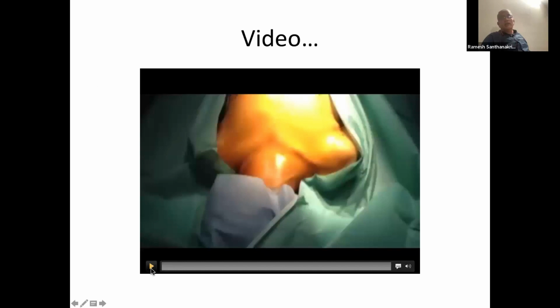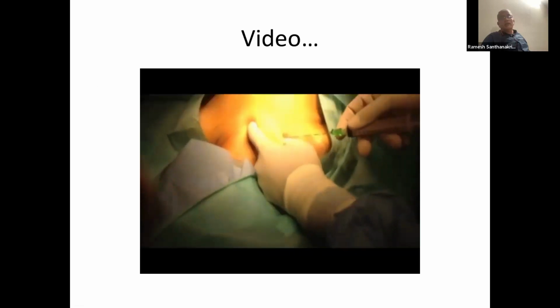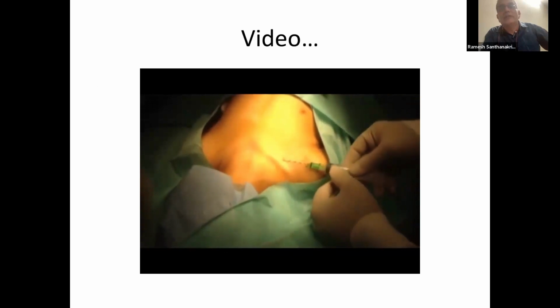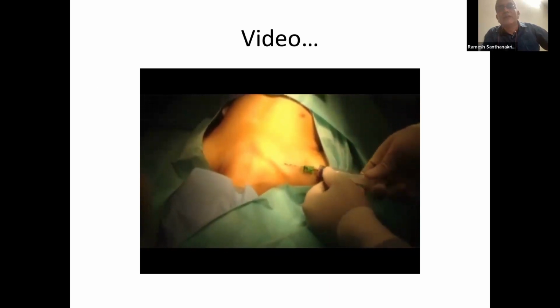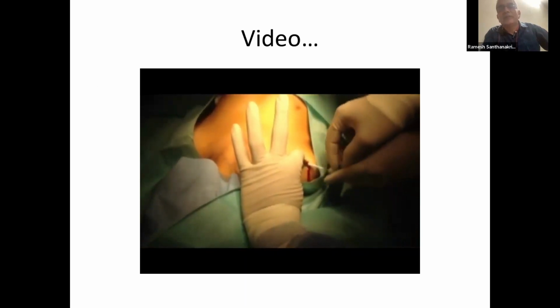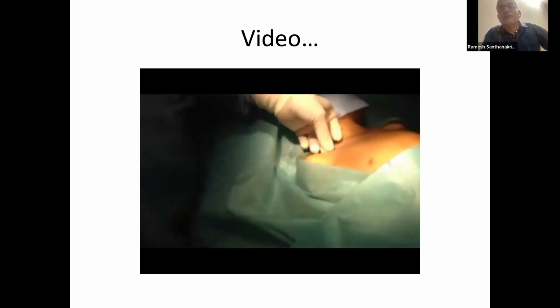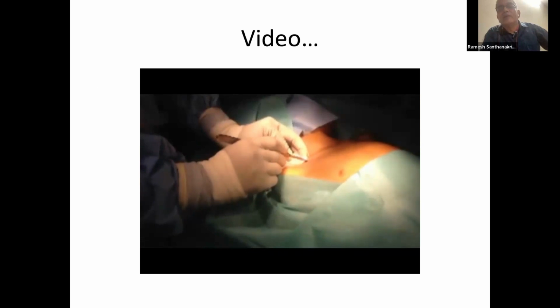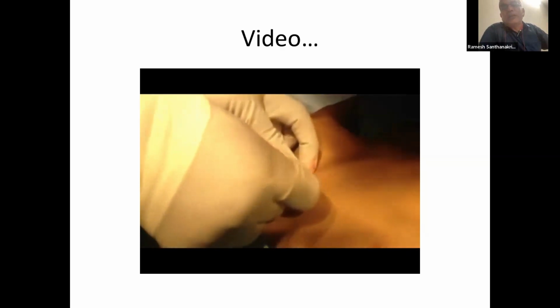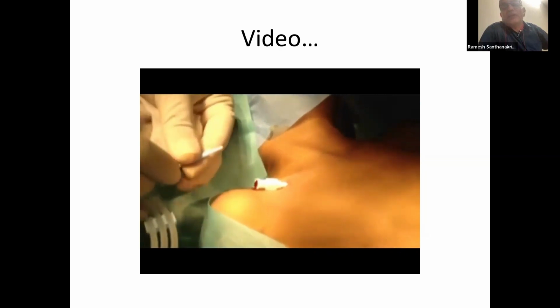Okay, this is a video. I don't know if anybody is interested. You can see the video in which we place the port, to show that actually we do. This is where we are planning about the jugular vein or a subclavian. This is basically a subclavian, in which you are accessing the subclavian vein, and once we put a needle and a syringe, we aspirate it, we make sure that it is in the vein. We put a guide wire into the subclavian, and once it is secured, we take out the needle and do a little dilatation of the tract.